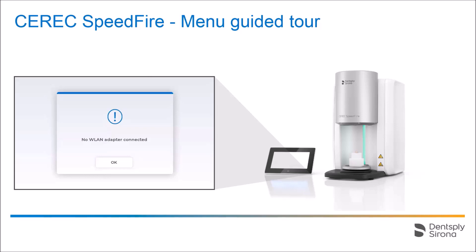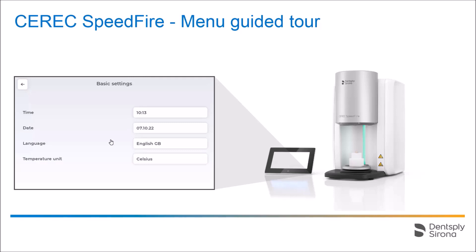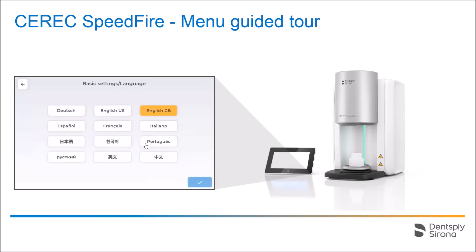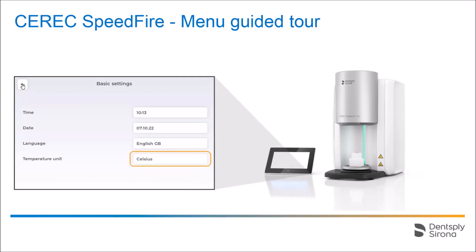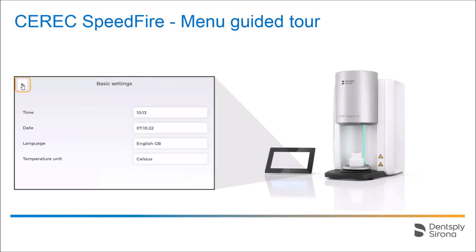Back in the settings submenu, we take a look at the basic settings. Here you can modify the date, time, language, and temperature unit. For demonstration purposes, we tap the language selection button and all available languages will be displayed. If desired, you can switch to a different language. We return to the basic settings overview and take a look at the temperature selection in the next step. Here you can choose between Celsius and Fahrenheit. Without making any modifications, we go back to the overview and leave the basic settings area to return to the settings overview.